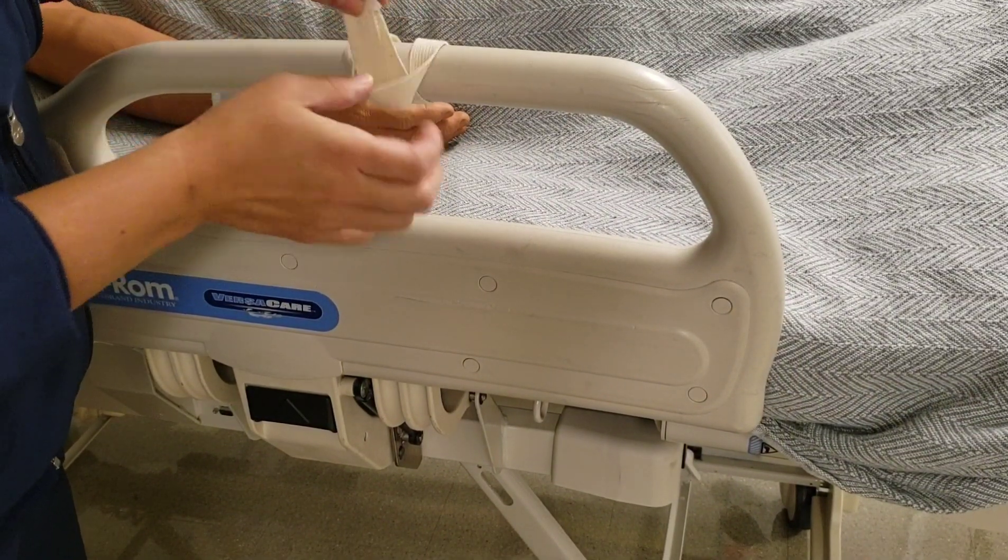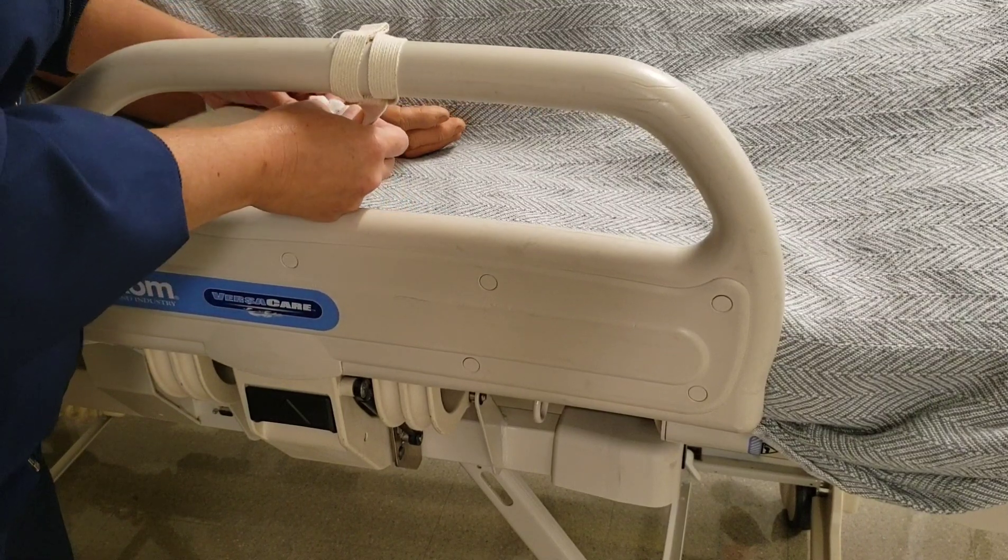Never attach a restraint to a moving part — for example, a bed rail — that could injure the patient when it moves.